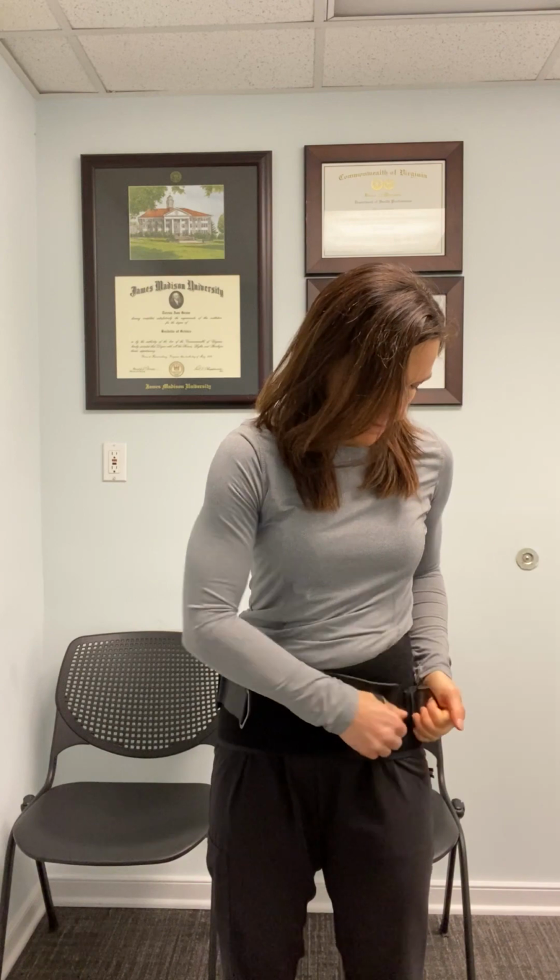first. Then you're going to loosen these side braces here. You can see a little bit better. So there's extra on both sides. What I recommend you do is take your elbows to your side. You're gonna pull almost as tight as you can, and you're gonna snap those bad boys down so it's nice and tight and firm here.